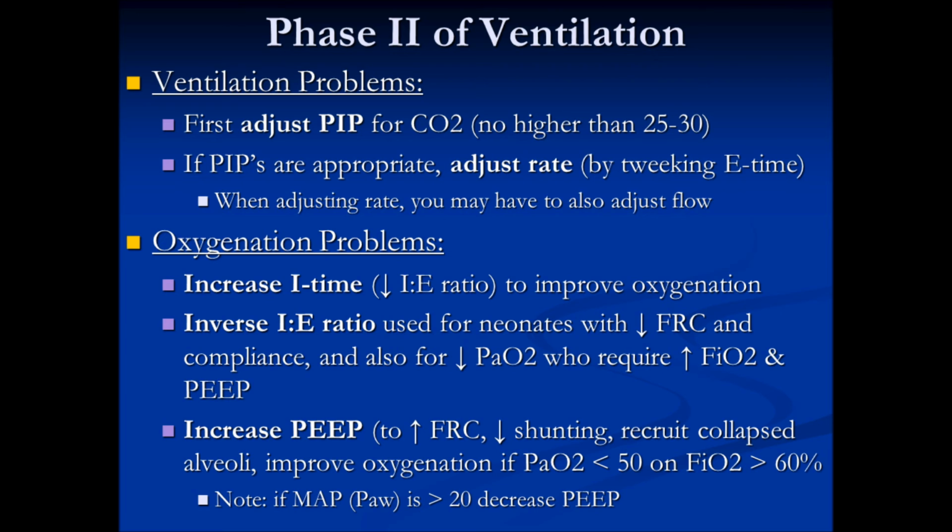The only time that this is not what the NBRC will have as an option is when the baby has stiff lungs or if it's a preemie. For those babies, you can go all the way up to 40 of PIP. So don't be alarmed if they have a question and everything looks good, but they have a really high PIP, say 35 or something like that. They're just trying to bait you to not choose that answer, but that will be the correct answer if you have a history in the scenario of stiff lungs, so RDS, BPD, or prematurity.